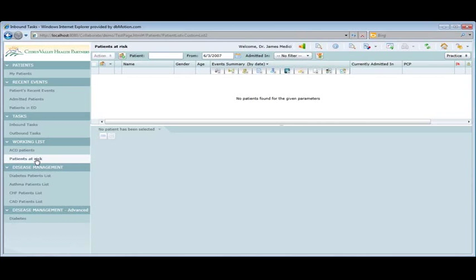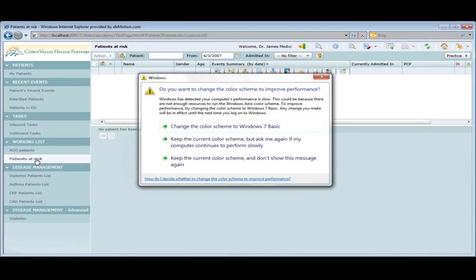So it was a request that we had from organizations to set beyond the ability to personalize at the end user level. So I want to see my patients that have X, Y, Z. But the organization says, we have a need here. We have an outreach program for elderly at risk for falls or whatever the case may be, or a hepatitis A outbreak in the community.